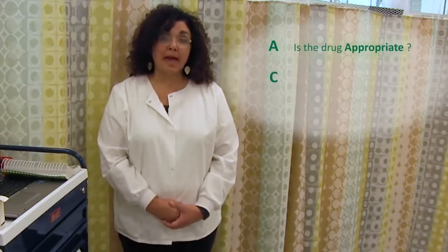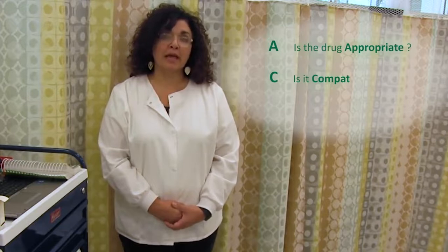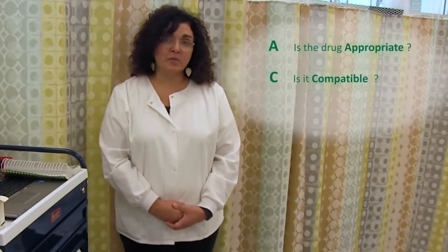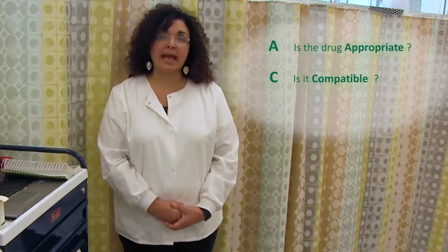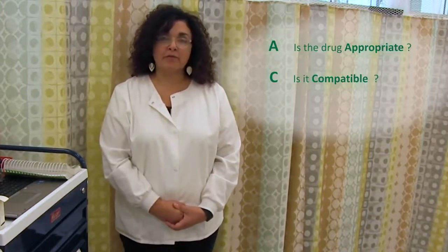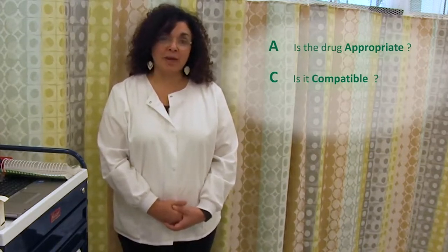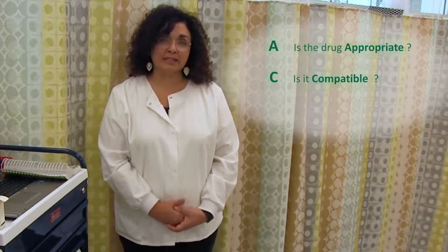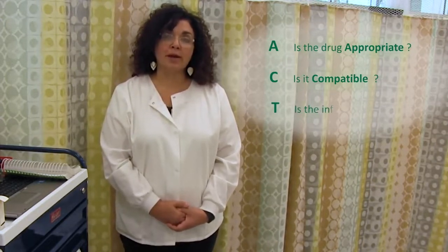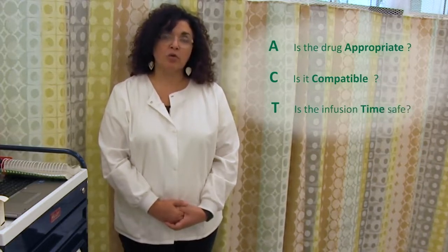C: is it compatible? When you're giving an IV push through the primary line, the IV push medication will share the same space with the primary fluids and any additives in the primary fluids, such as potassium chloride, for example. So we have to make sure that the medication is compatible with the primary fluids and any additives within it. And T: time.